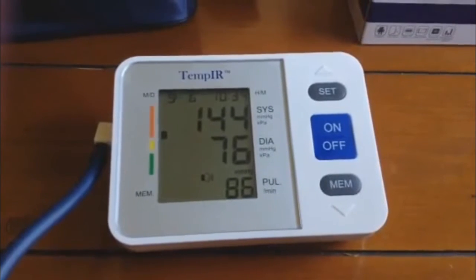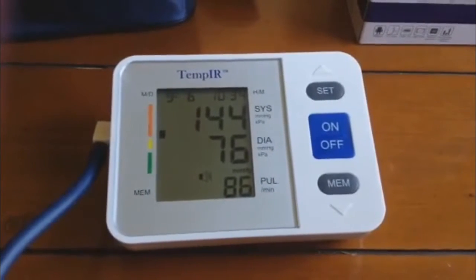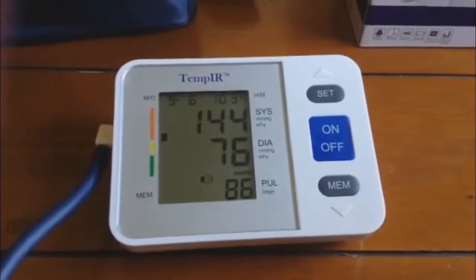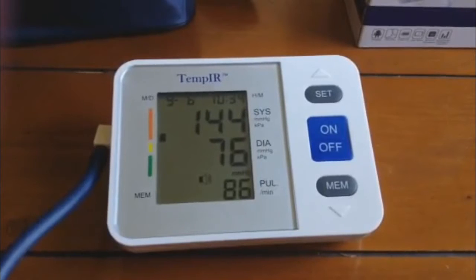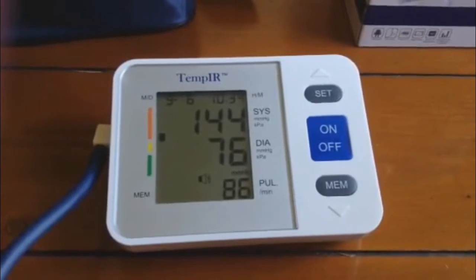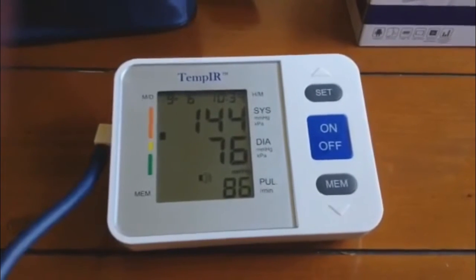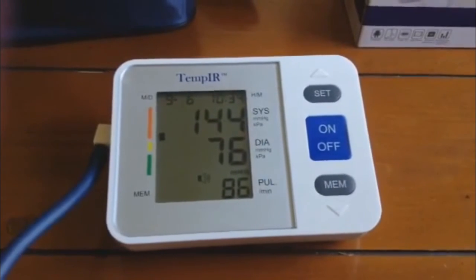Your blood pressure is systolic pressure: one hundred and forty-four millimeters mercury column. Diastolic pressure: seventy-six millimeters mercury column. Heart rate: eighty-six times per minute. Measurement result: abnormal.